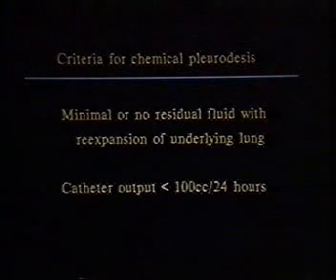percutaneous pleurodesis. Here's a patient who has a metastatic nasopharyngeal carcinoma to the left pleural space. You can see the obvious left pleural fluid collection here. And here is the patient with a pigtail catheter seen down here in the very dependent part of the pleural space. You can see the fluid collection has been adequately evacuated. The drainage at this point was less than 10 cc's over a 24-hour period. And at this point, the clinicians instilled 500 milligrams of doxycycline.